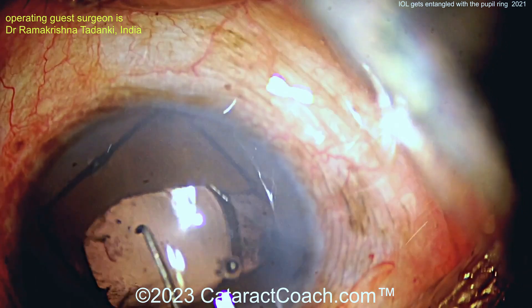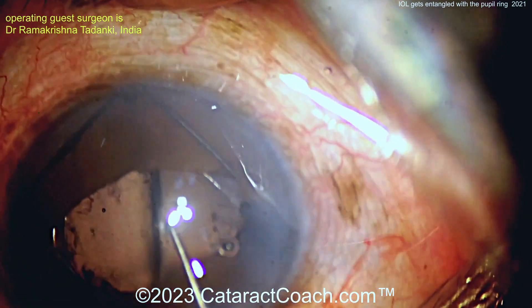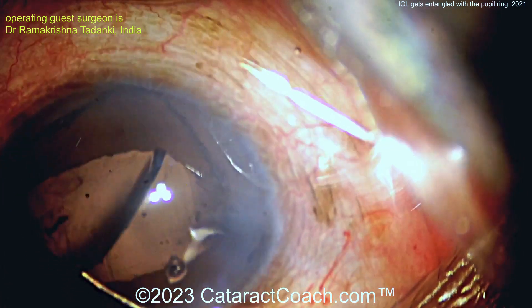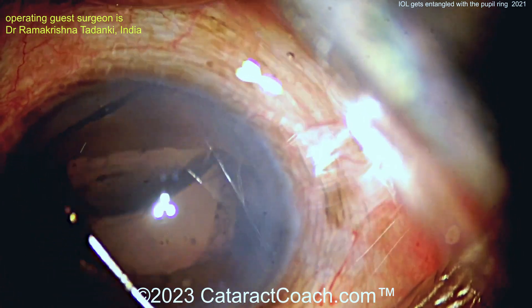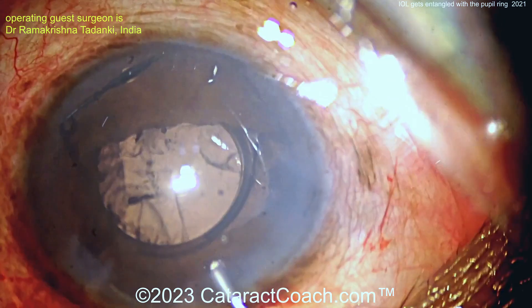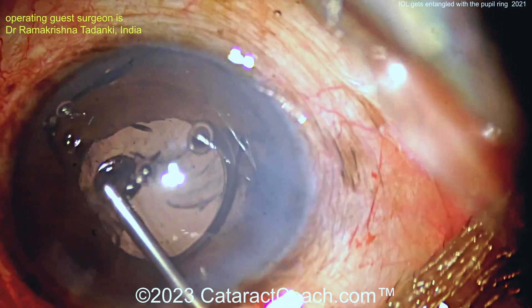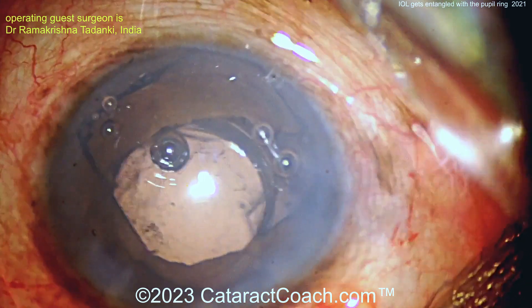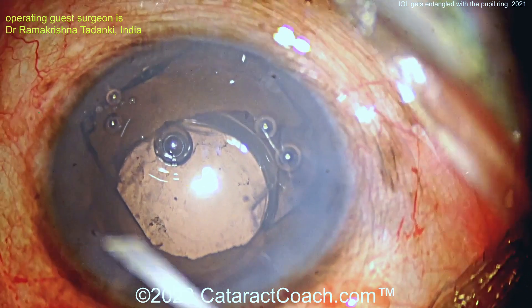So what are you going to do here? Think about it. Well, more viscoelastic is a good idea — maybe get that lens up, you've got to get it detangled. Now there's the viscoelastic going in. You've got to get that ring out of the eye too — bring that ring out of the eye.